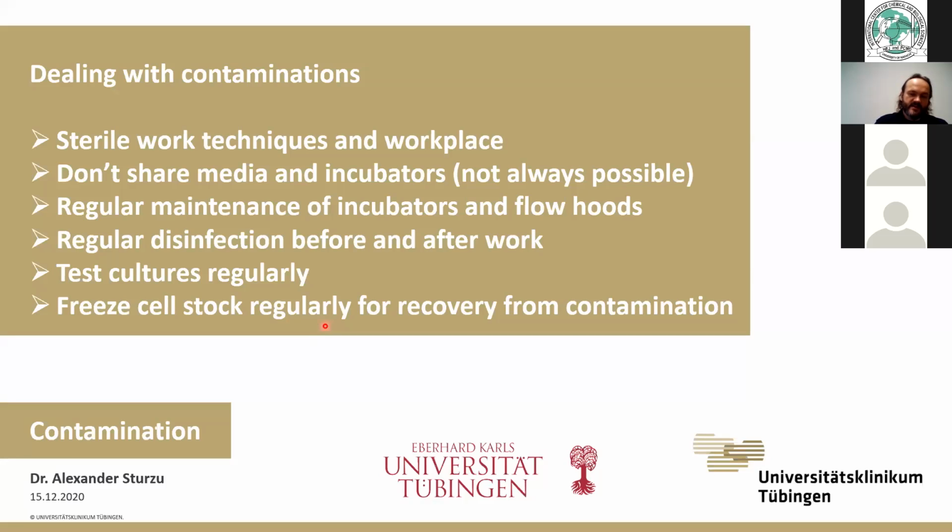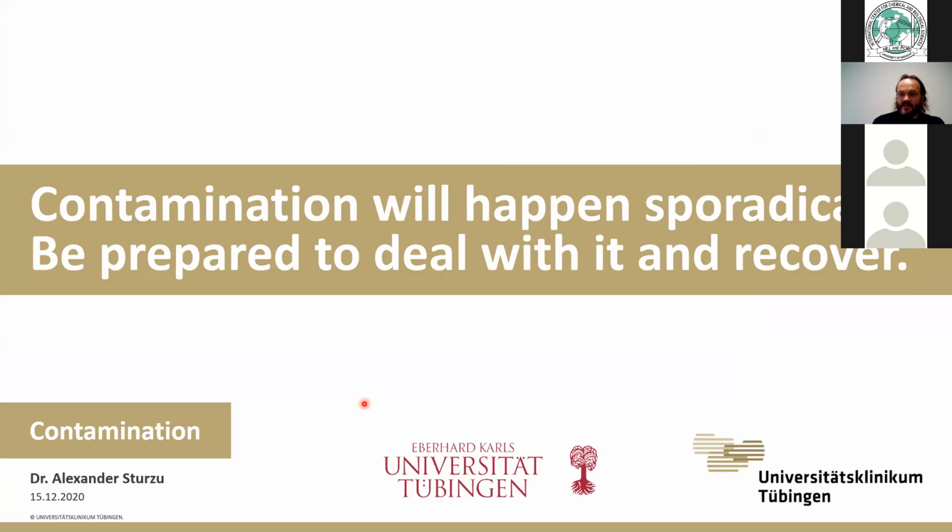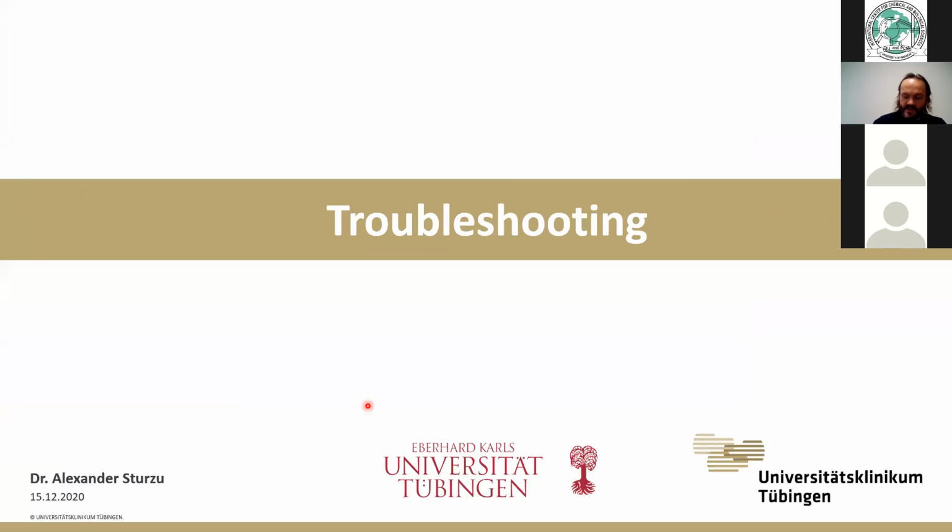For mycoplasma, you can every now and then test your cultures. And for the recovery from potential contamination, it is important to keep a stock of frozen cells. So in summary, if you're working with cell culture, then contamination will happen sporadically. And the best way to deal with it is to be prepared and be quick to clean your work area and remove the contamination, and then start with a new clear batch of cells. So this concludes the contamination.